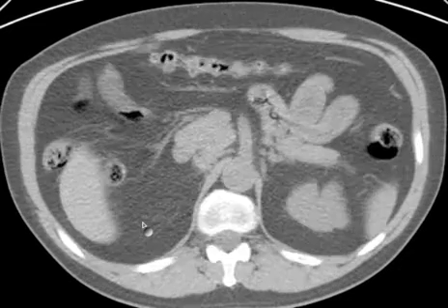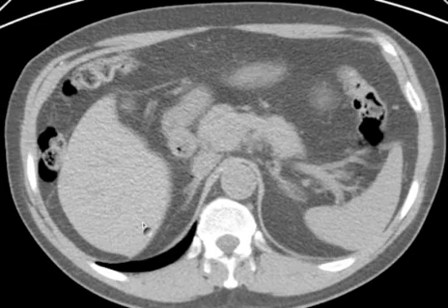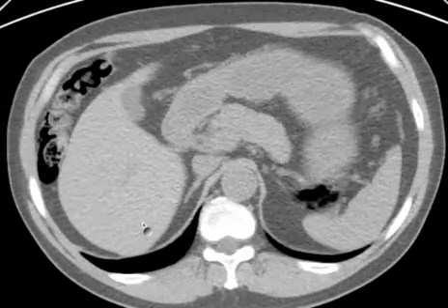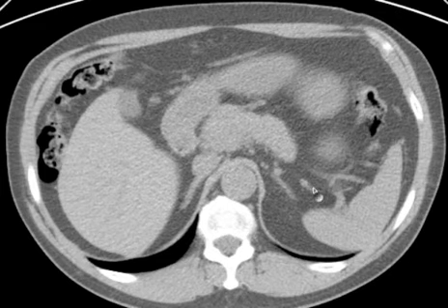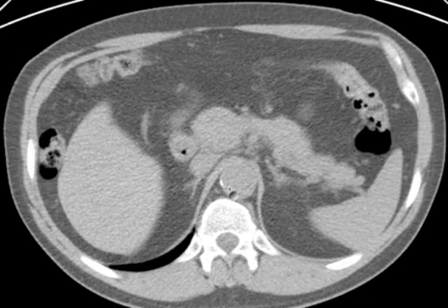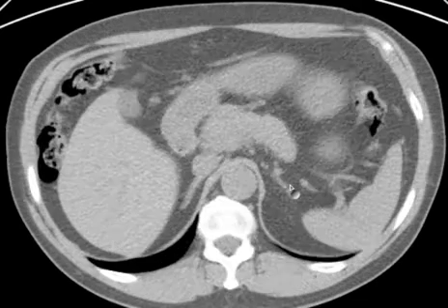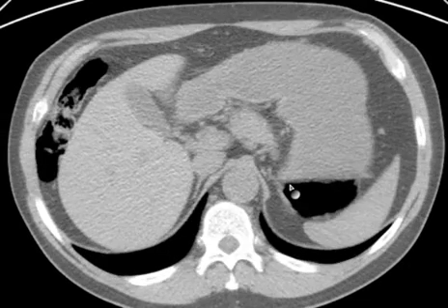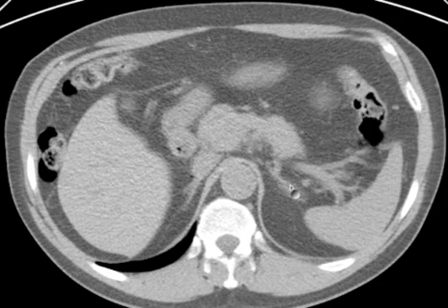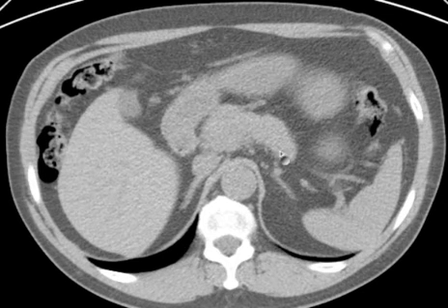The patient has pain, so get comfortable with those adrenal glands. Sometimes you go up here and you see a bunch of lines and you say which is the adrenal. Well, you follow most of these and you'll see that they connect to the spleen. They're coursing under the pancreas or the renal artery or renal vein, and you may get little tiny adrenal vessels.